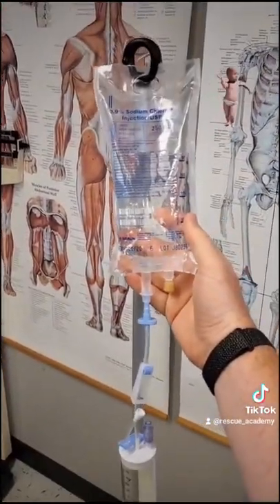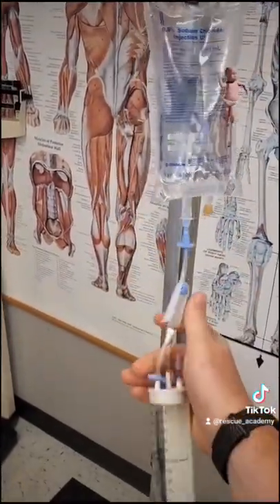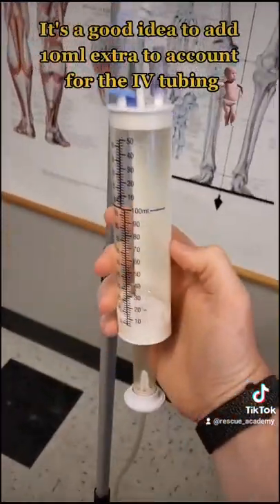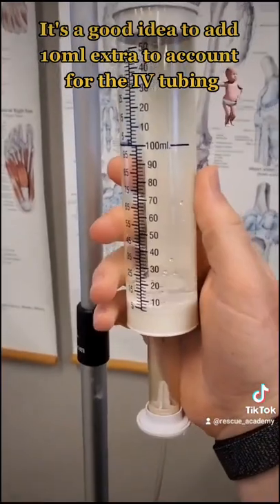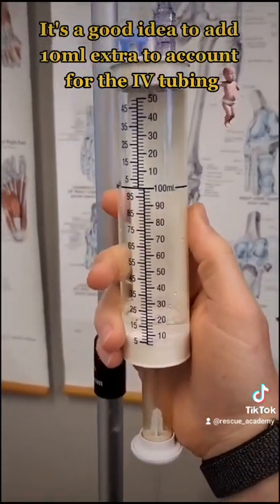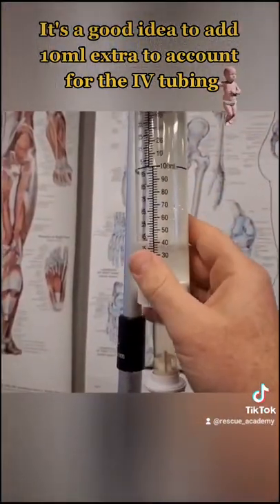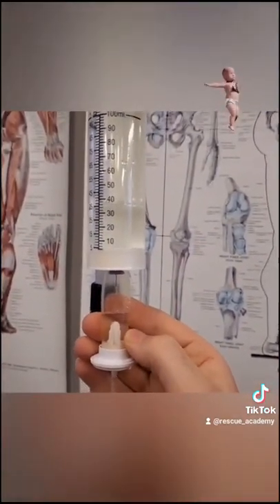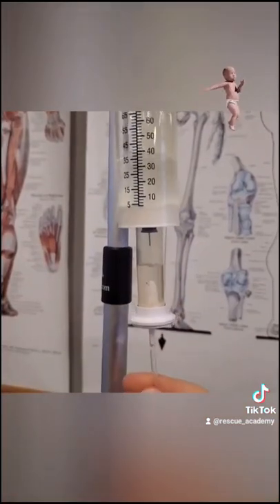My saline bag is hooked up to my Buretrol. I'm going to go ahead and open it up. As I look inside this chamber, it's filling with fluids. Once I have 40, I'm going to make sure my drip chamber is half filled, and then I can go ahead and start my infusion.